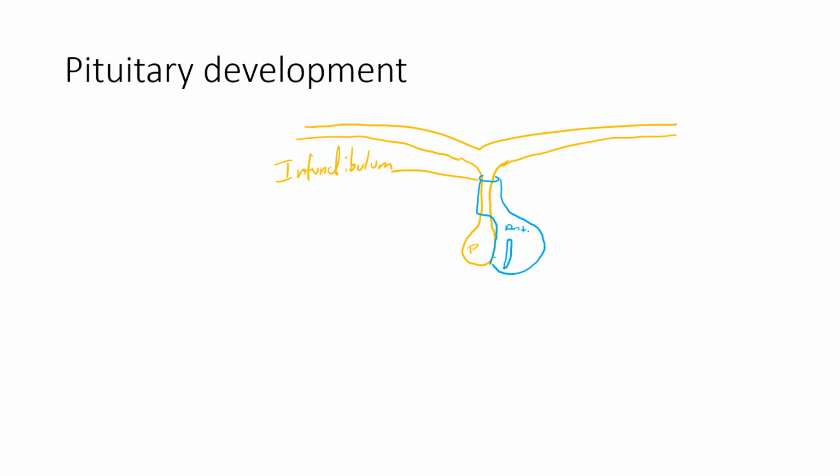The anterior pituitary can be divided into three parts. The part that wraps around the infundibulum of the posterior pituitary is called the pars tuberalis, P-A-R-S, tuberalis. The main part of the pituitary, the one that does most of the secretion, is called the pars distalis. And then this little bit right here, it ends up being rather poorly differentiated, is called the pars, ooh, that was bad.